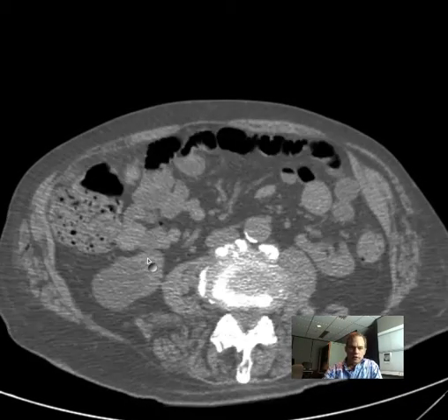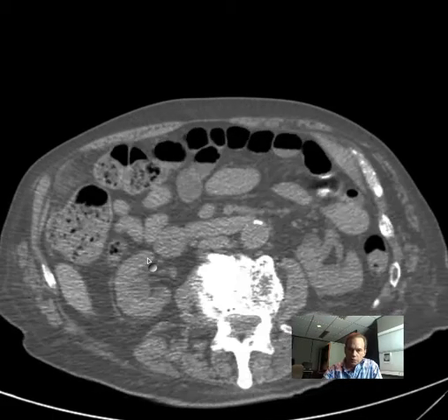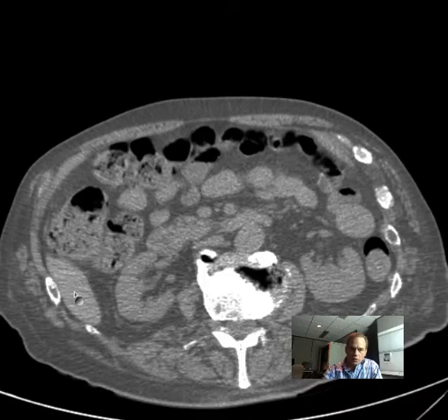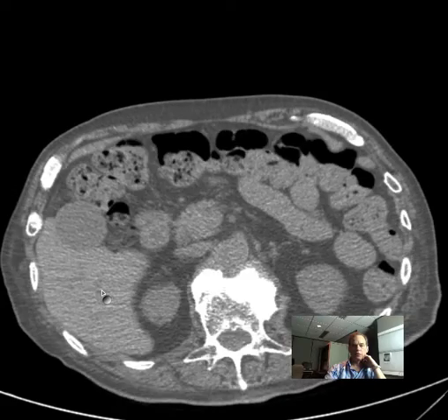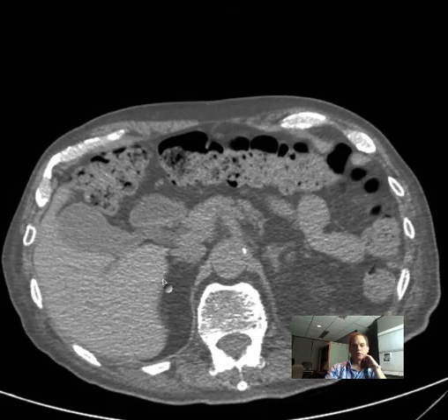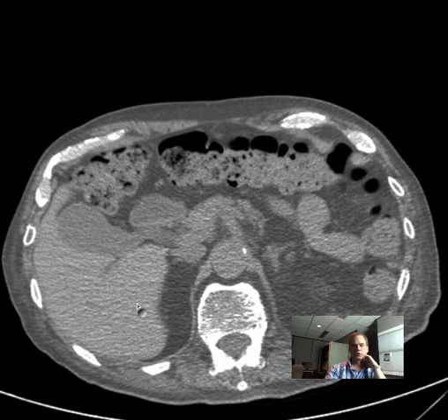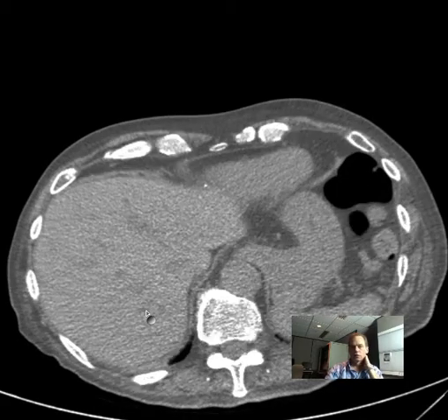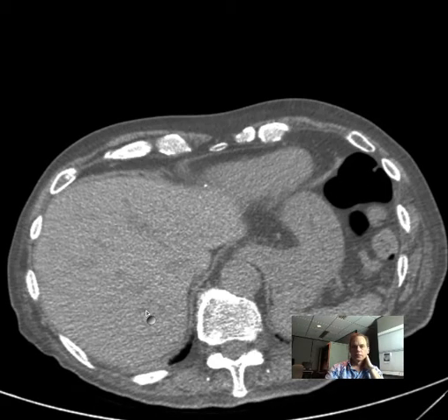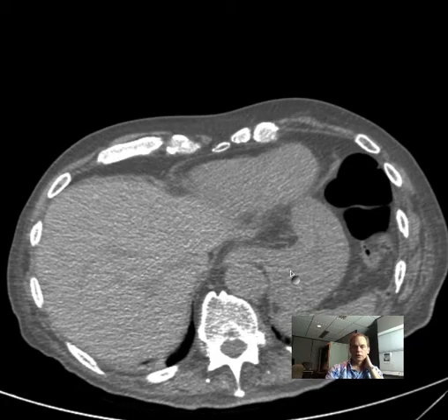Going down a little bit lower — this doesn't have as much anatomy as I had hoped, but coming up into the liver: here's the liver, here's the gallbladder. As we go higher we see the spleen and the stomach.